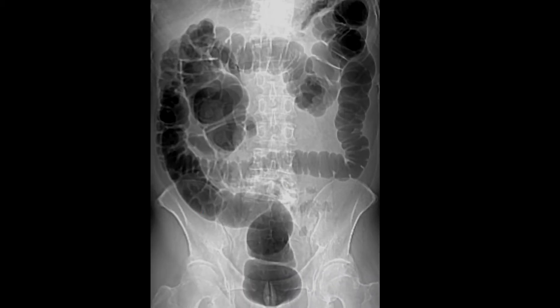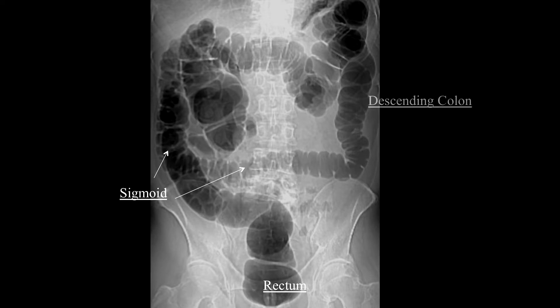This is a case where the patient would have had a very difficult — and potentially failed — colonoscopy. If you follow from the rectum up into the sigmoid, the sigmoid actually dives all the way up into the right upper quadrant, comes back down, and then across here is the descending colon, the transverse, and then here is the right colon and the cecum. So your right colon is actually medial to your sigmoid — obviously a very difficult colonoscopy.